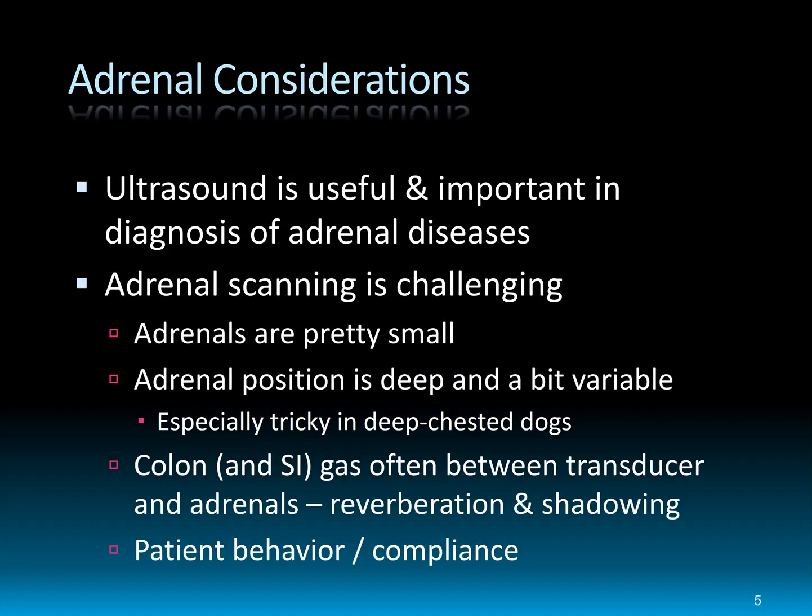That said, it can be somewhat challenging to evaluate the adrenal glands fully because the adrenal glands are pretty small and their position is not ideal. They're kind of tough to get to. The left one's not so bad, but the right adrenal gland is tucked up under the ribs. There's colon in the way, and so gas can get in the way. Fecal material can shadow, especially in deep-chested dogs where the right adrenal gland's tucked up that much more up under the ribs. So there are some issues that can make life a little difficult when you're trying to assess adrenals.